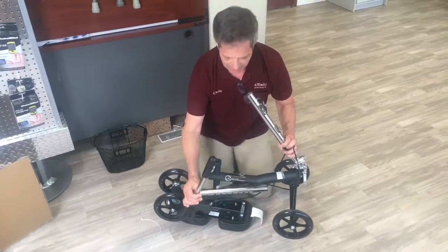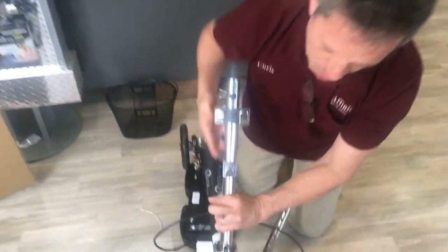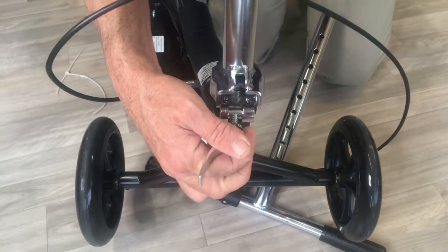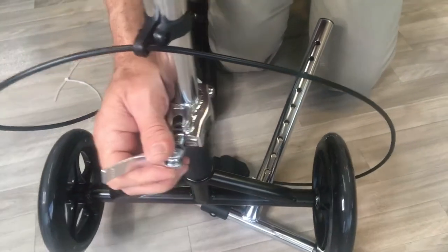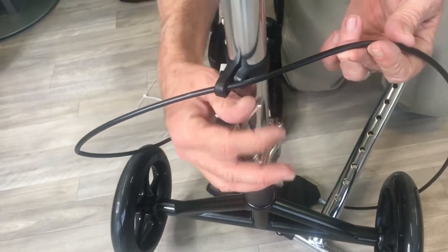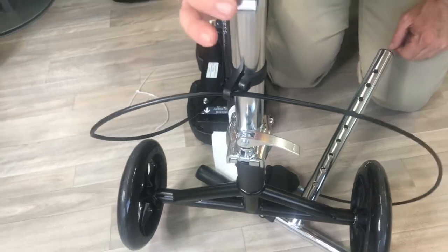Let's start with the folding mechanism in the front. You have a little piece that just needs to slide over to your left, then put the handlebars up in place and allow that piece to slide back where it was. You'll notice there's a little button that engages, and then you want to slide this mechanism up and swing it down to lock it in place. Now this is completely secure.